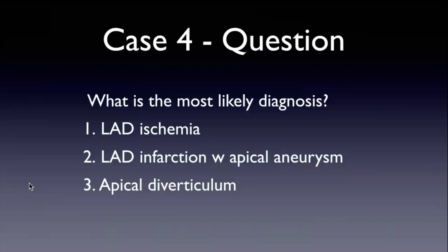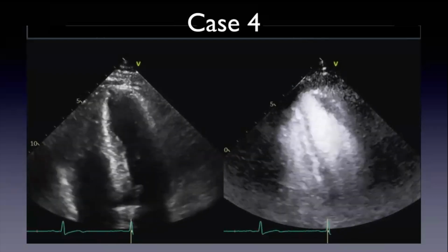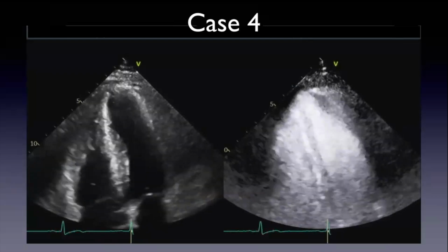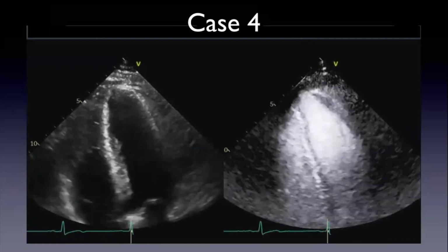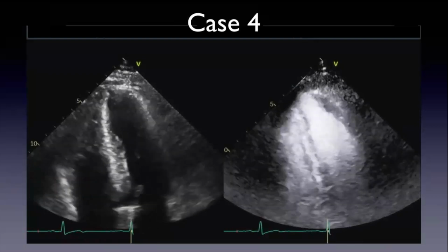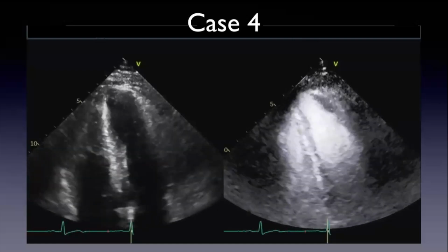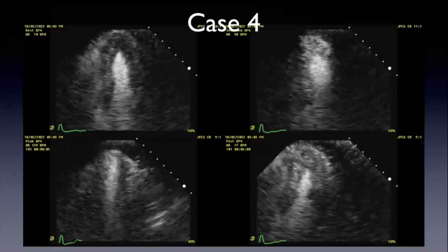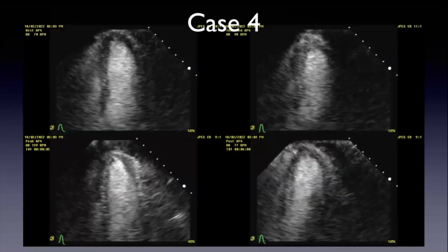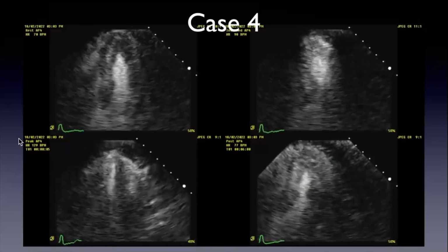Okay, so here's the rest echo after the stress echo. Apical 4. It looks bigger now, right? You can certainly see it better. I think we never saw it on the resting images in the stress echo. It goes to your point: if you go back and look at the images of the apical 4, it doesn't really look that foreshortened, right? So it tells you sometimes it's difficult for us to catch the true apex, and sometimes you have to really scan through a little bit. It's a little bit foreshortened, but it's pretty triangular.